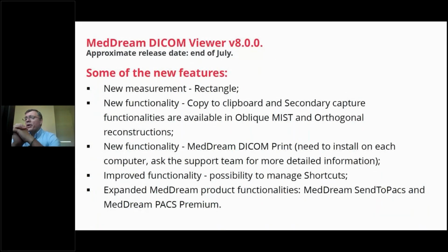This became one thing, and it will be covered with the same certification options as MedDream. Of course, PACS, SendToPACS and Video Station are just secondary products for Softneta. MedDream is still the number one product, which we are most proud of at this point.